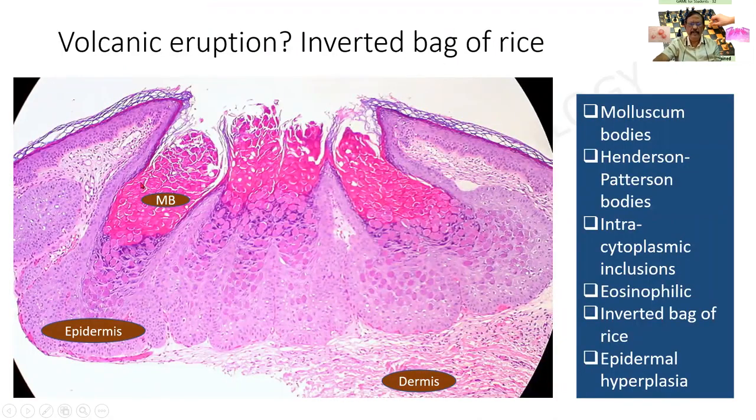This is the lesion which will be focused, or part of it will be focused and kept for you. This is a section of the skin. All the violet color is the epidermis, and the pale fibers are all the dermis. You find that the epidermis is thrown into lower folds. And this particular feature is called acanthosis. Acanthosis means broad downward folds of the epidermis.